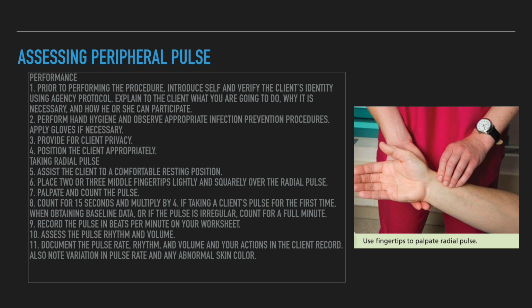Next, record the pulse in beats per minute on your worksheet. Last, document the pulse rate, rhythm, and volume and your actions in the client record. Also note variation in pulse rate and any abnormal skin.